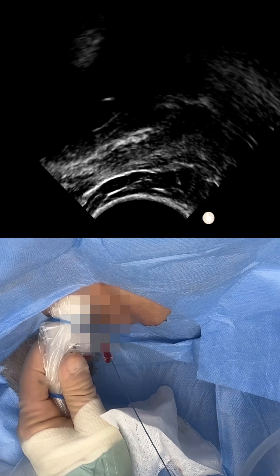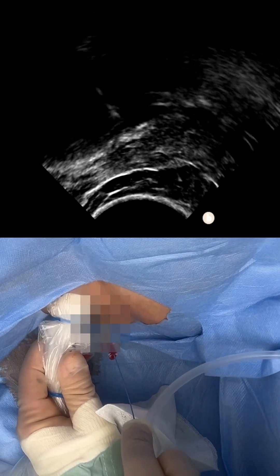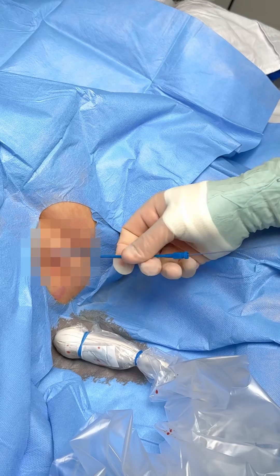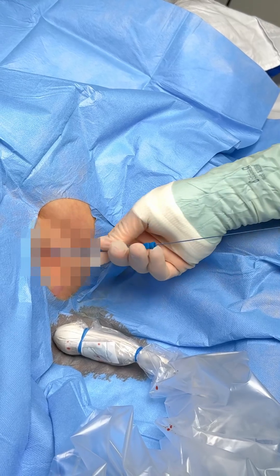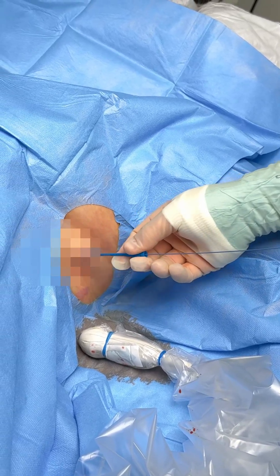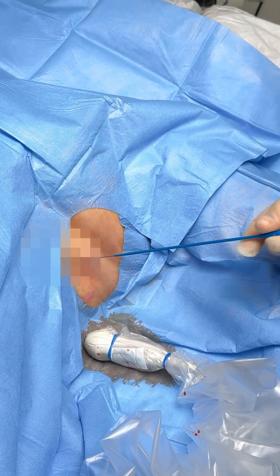Have the guide wire ready and insert it under real-time ultrasound guidance. Use an 8-French dilator. It should pass easily as the guide wire is super stiff, which prevents kinking.